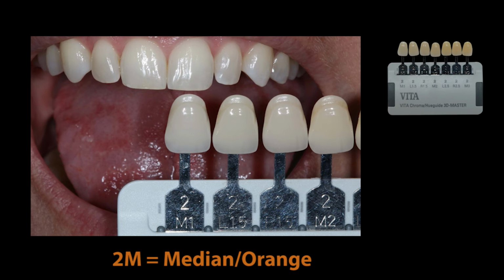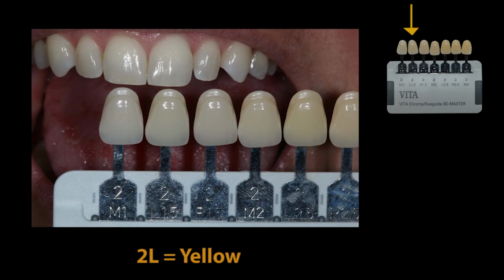Now let's, as a reference, look at the next shade tab, a 2L 1.5. Now what do you see? You know that the L stands for yellow. Now notice, now that you know there's yellow in the 2L, how the shade tab looks a little more yellow. Now reference the natural tooth. What do you see? Does it look too yellow?